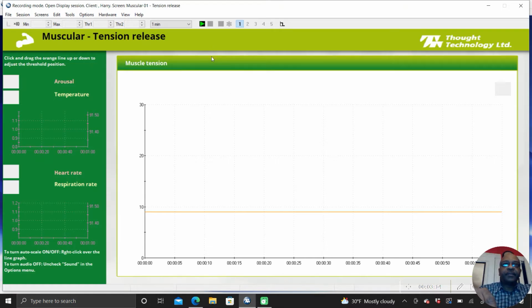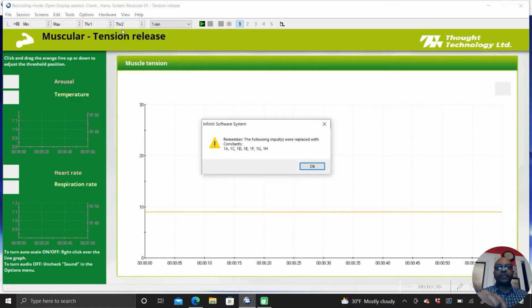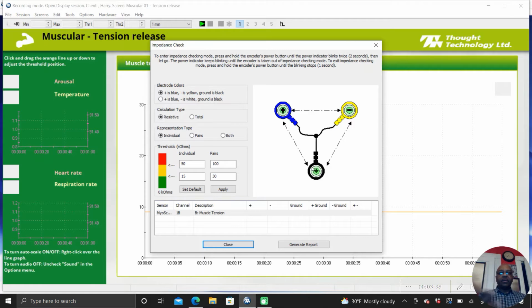Okay, so now, normally we would just click on the arrow to start recording, but instead of doing that, we're going to go to Hardware, and we go to Impedance Check. It says remember the following inputs were replaced with constants and so on. We just click OK, and now we're on the Impedance Test screen.